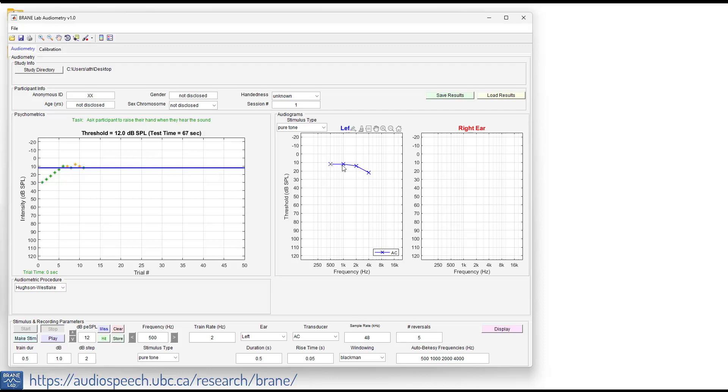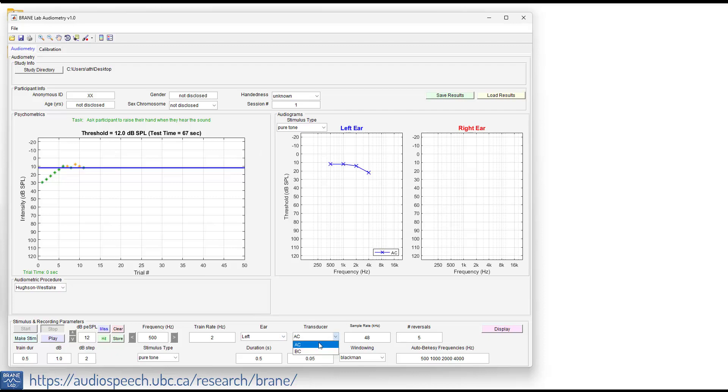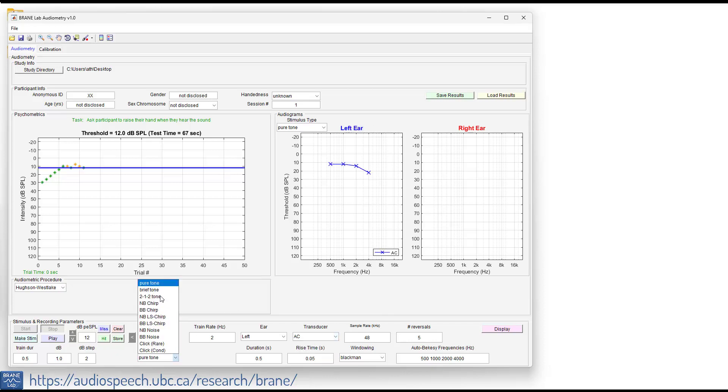And now we have the audiometric thresholds for 500, 1000, 2000 and 4000 hertz. We can go on and do right ear if you have bone conduction set up. We can do air conduction then switch to bone conduction so you can get the bone conduction thresholds, and you can move on and do all the different types of stimuli that we have listed here.